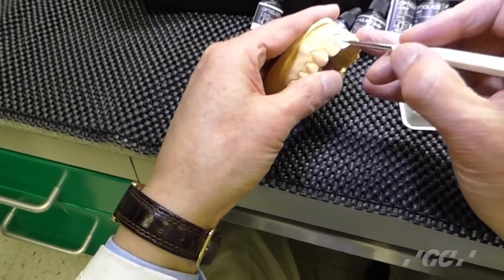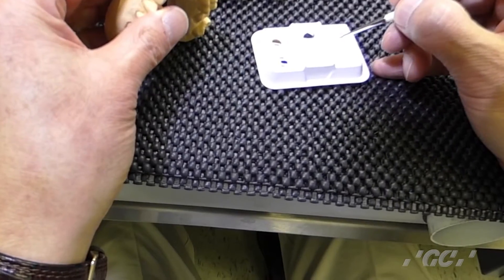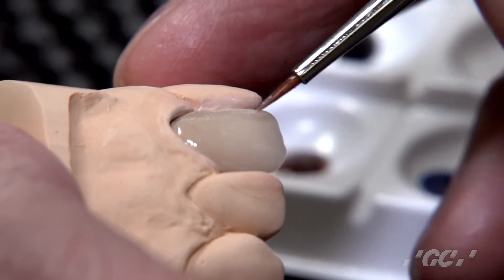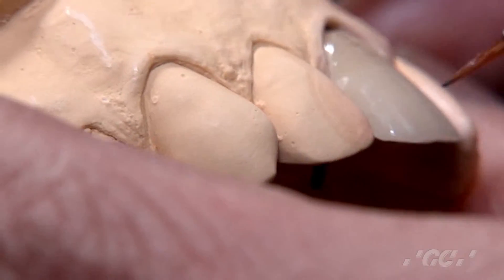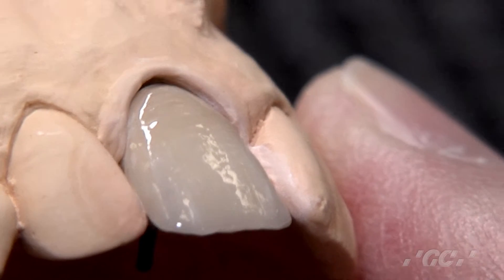Then next, if we want to add more internally, this time exactly the same way — just paint it on. Then if you want a blue effect in the corner, just paint it on like an oil paint or water paint.